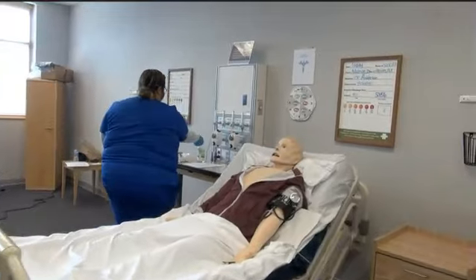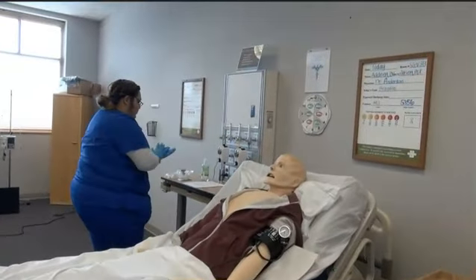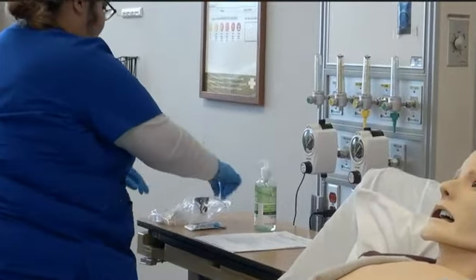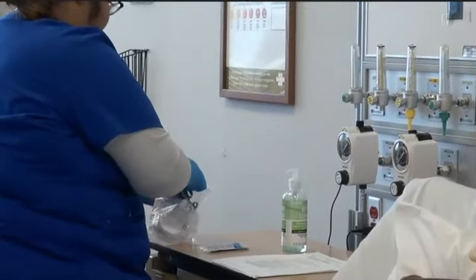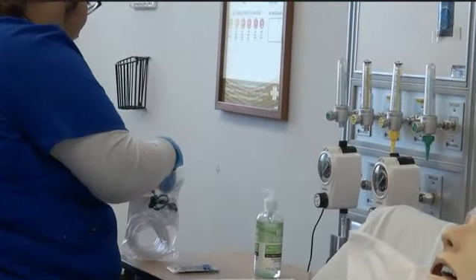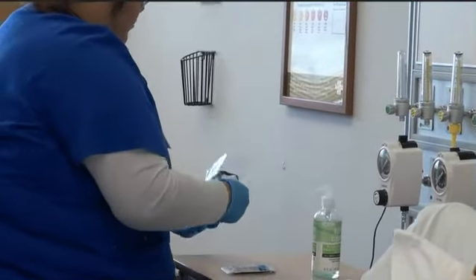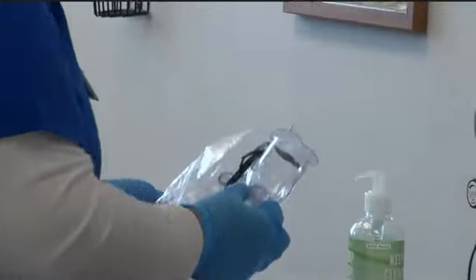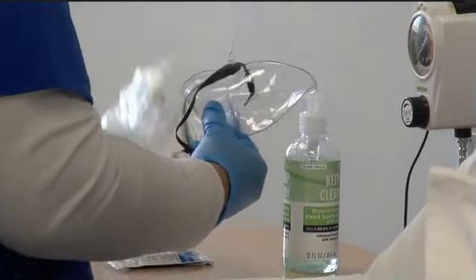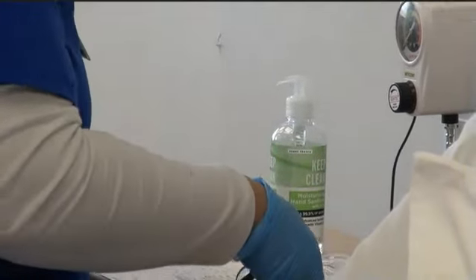She will use an alcohol-based hand rub or wash her hands prior to handling the small volume nebulizer. In this scenario, she is using a mask, but normally we would use a mouthpiece. She then will take out the nebulizer piece itself.